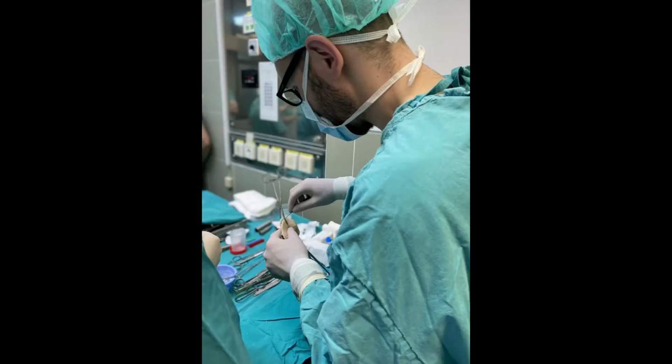The second picture is showing me clamping the two-part mold. This was the best approach because it turned out that the bone cement polymerized really quickly, so we couldn't do the injection. We put some of the bone cement between the two faces of the molds and clamp them together.